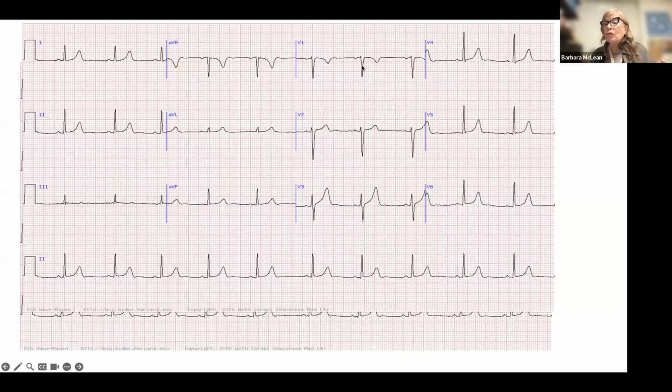So I'm looking at direction and I'm looking at time. The width of my total QRS should be less than 0.11. Anything wider than 0.11 signifies that I have a conduction delay. So that's what I'm going to be in search of. What's causing my conduction delay, when I have one? This EKG does not have one.